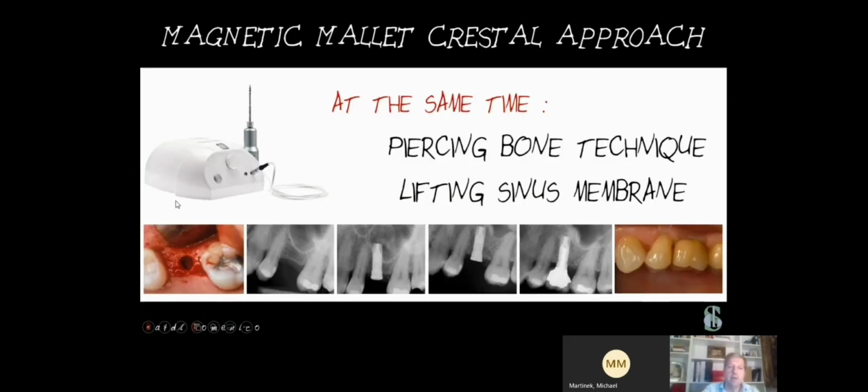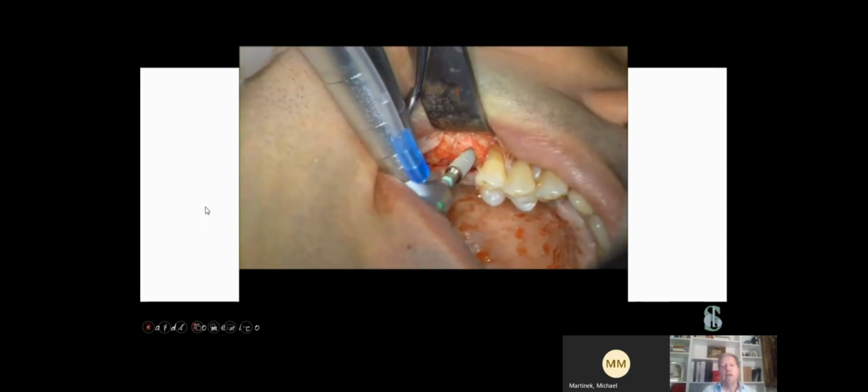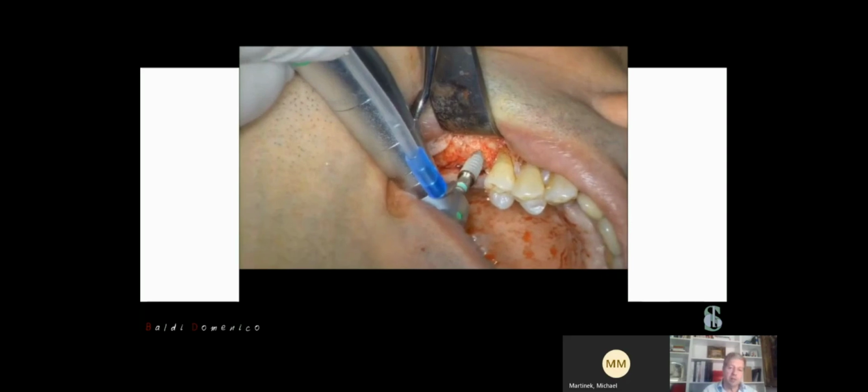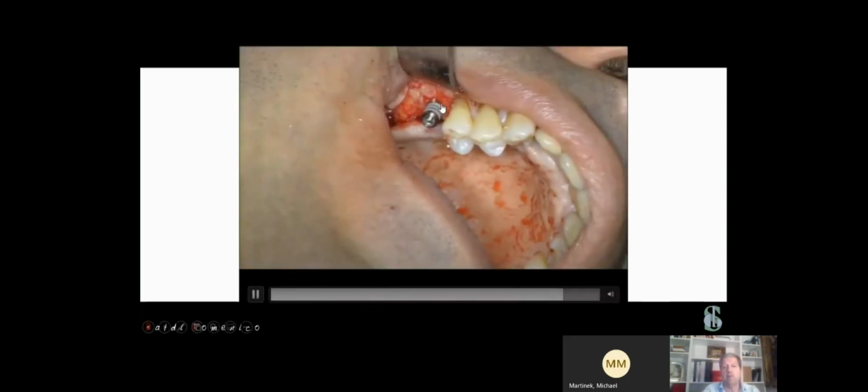So using the magnetic mallet in order to obtain the sinus lift, we can really manage at the same time the bone perforation and the sinus membrane elevation. And at this moment we can place the implant.